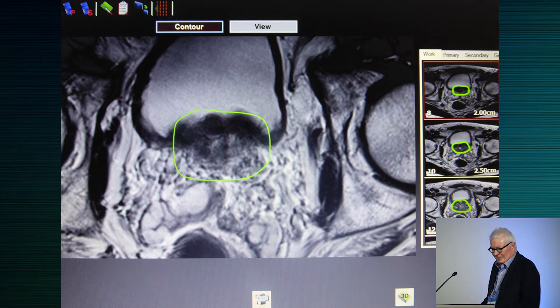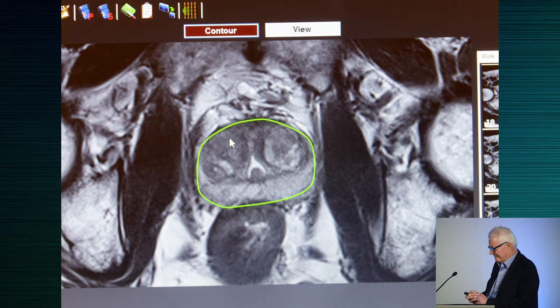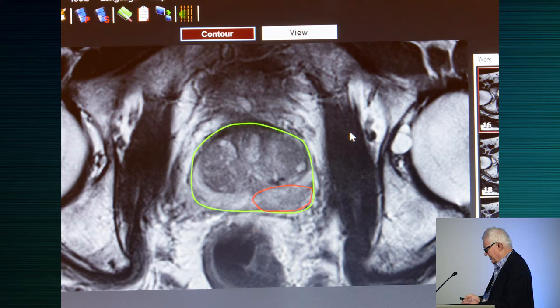And Rod outlined the technique, and I just wanted to put it into the context of the operating theatre. So the software that we have on our device outlines the prostate, and we contour the prostate from the top to the bottom, down to the urethra from the bladder. And we also outline the nasty area of suspicion there. And the whole idea is to match this with real-time ultrasound in the operating theatre.